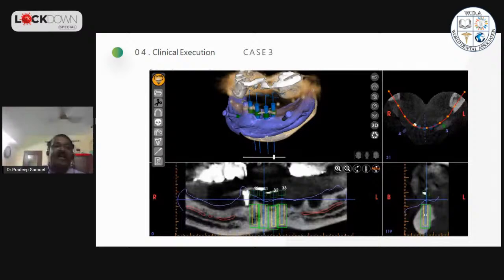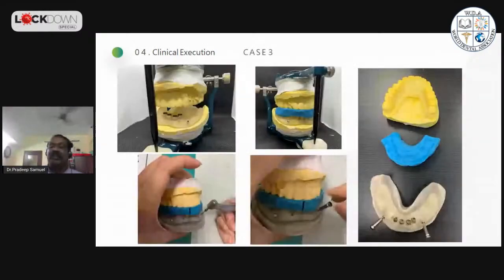Yeah, and this is the surgical guide. As I've told you, this is a tissue-based surgical guide, so it is entirely on the tissue. So we have planned this using the surface scan of the patient, that is, on the tissues. So when we place this, suppose we place this on the patient directly and press it, our whole virtual planning that we have done goes haywire. That is, it depresses and the angulation may vary, the depth may vary, all these may vary.